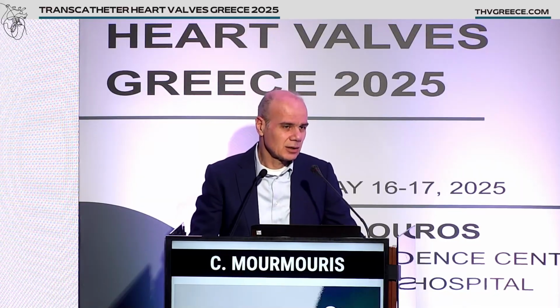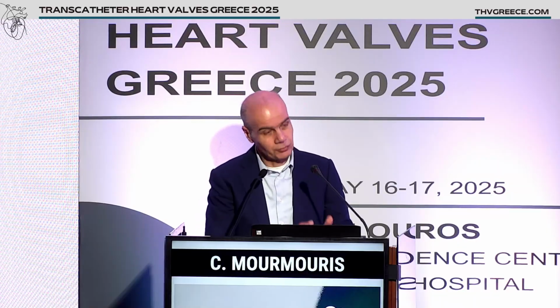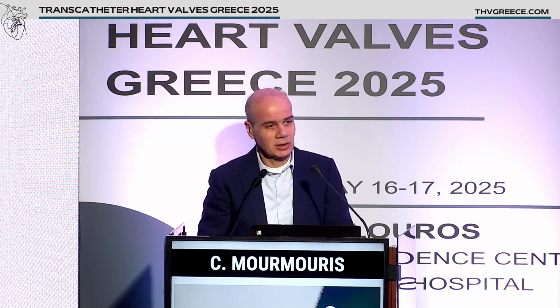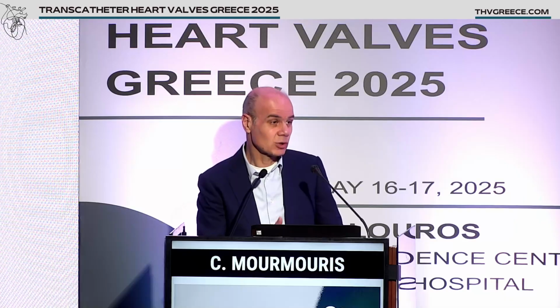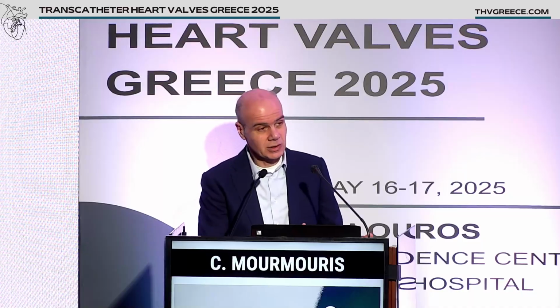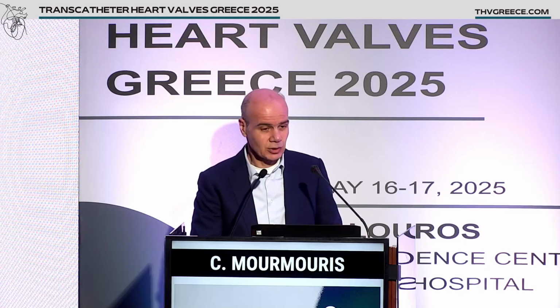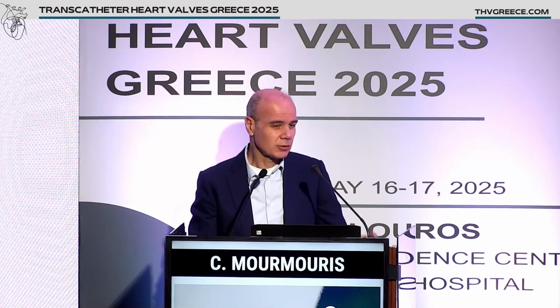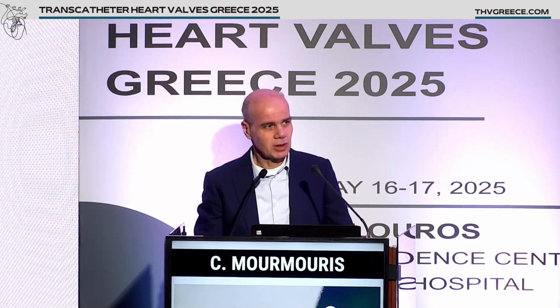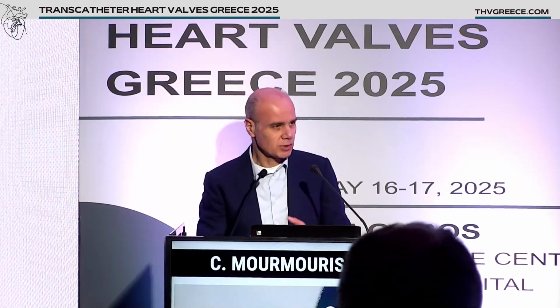Usually in my department we use a monophasic contrast protocol for TAVI, but in cases of tricuspid valve we use a triphasic protocol. We have 3 phases. The first phase is when we inject around 40 to 50 ml of 60% contrast medium and 40% saline.